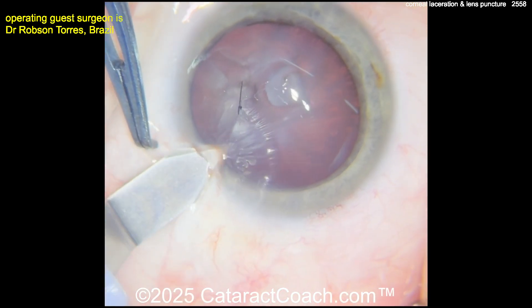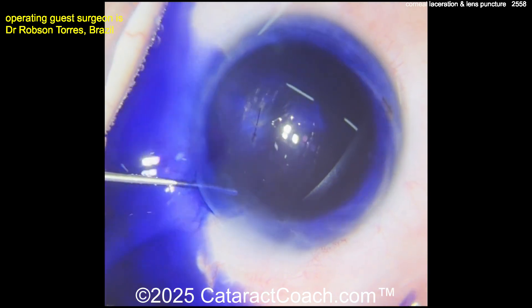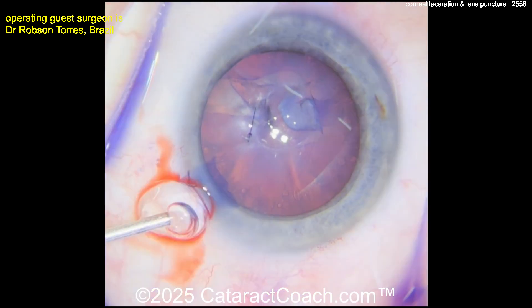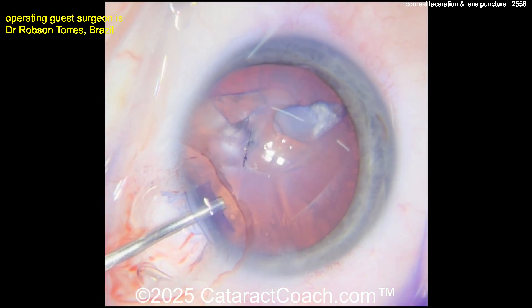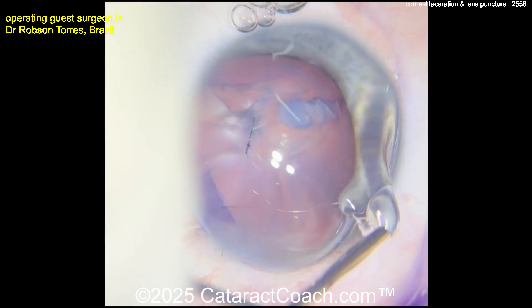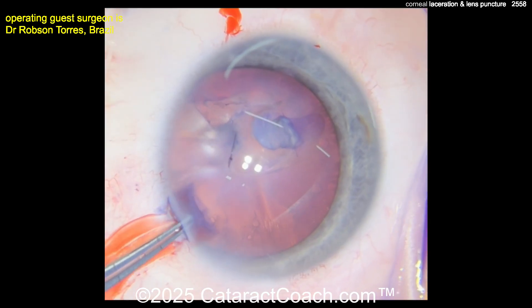Making an incision here, you're going to put some trypan blue dye in. Luckily there's no additional foreign body inside the eye — both eyes were checked and going to the posterior segment, there is no retained foreign body. It was just that object poking through the cornea and into the lens capsule. That's what the capsule looks like — look at the break we already have.